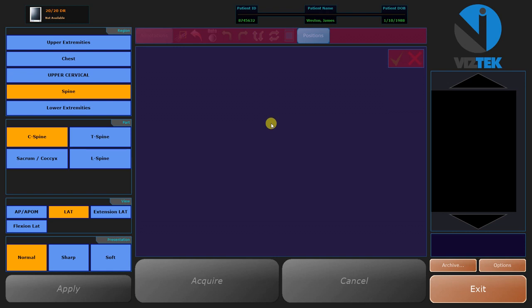Once you expose, the image will load into this box. It will also show up over here.